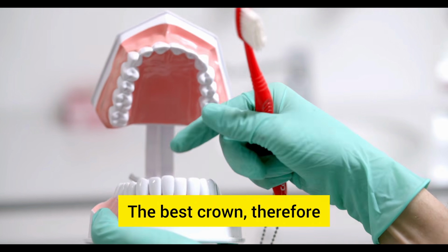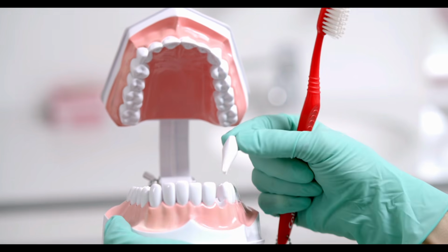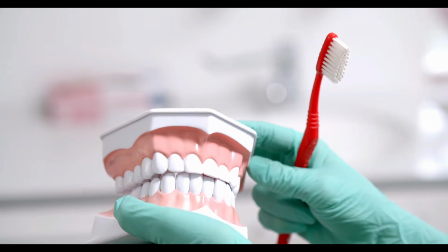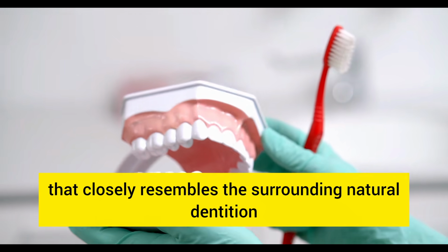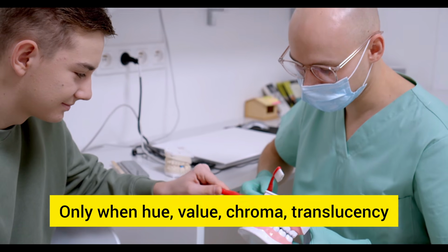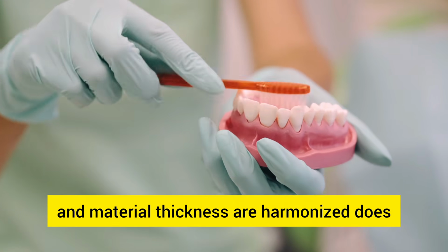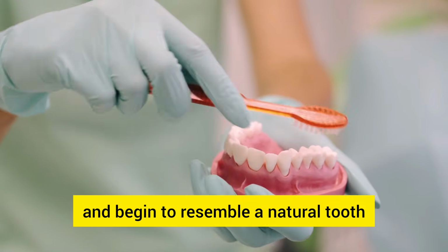The best crown, therefore, is not the one you notice first when a person smiles. The best crown is the one you do not notice at all. It does not necessarily have to be the brightest restoration. Rather, it must interact with light in a manner that closely resembles the surrounding natural dentition. Only when hue, value, chroma, translucency, fluorescence, opalescence, surface texture, and material thickness are harmonized does dental ceramics cease to look like porcelain and begin to resemble a natural tooth.